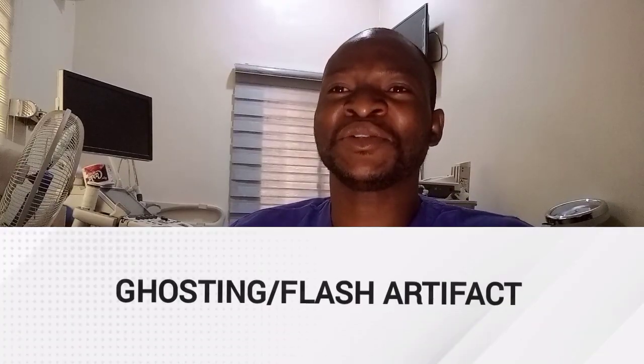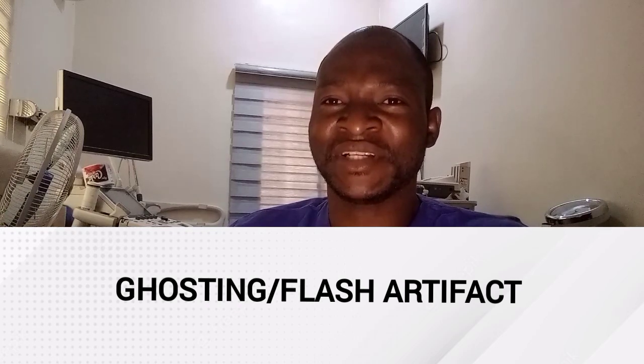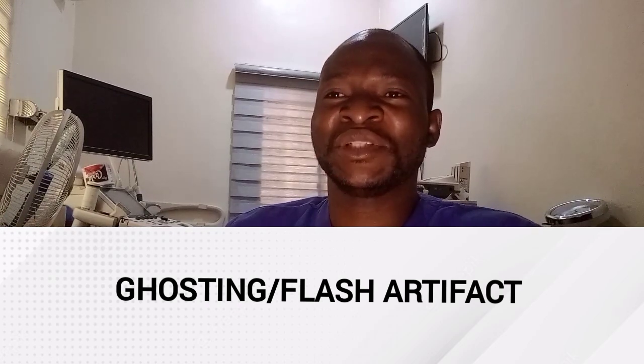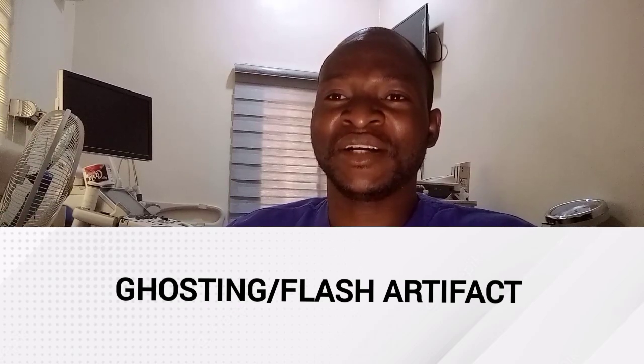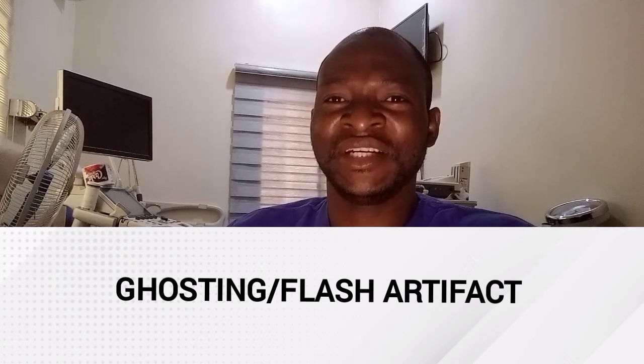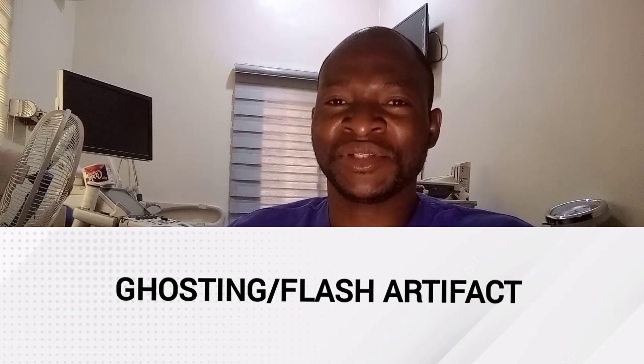Now, ghosting or flash artifact. This is a color Doppler artifact related to inappropriate color processing. For example, inappropriate color display occurs over non-vascular structures such as soft tissue in the upper abdomen that move during respiration.